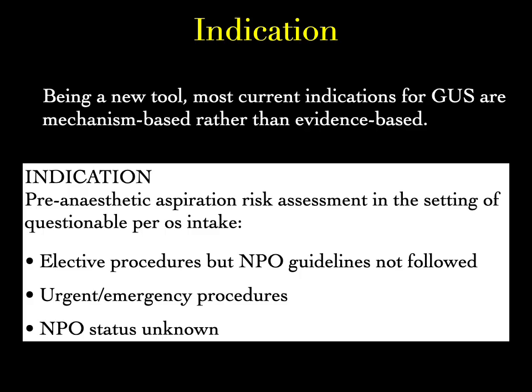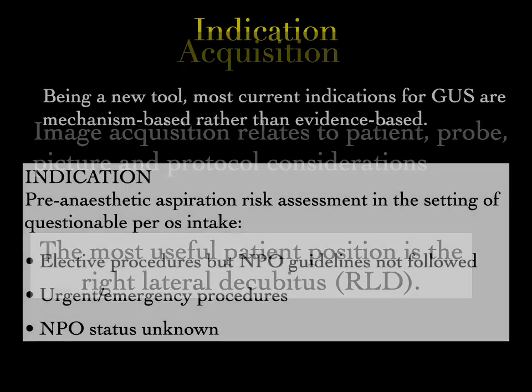It can also be done when somebody is unable to communicate, somebody with a trauma, or somebody unconscious. So in all these cases, you can check whether the stomach has contents or not. Then it helps you in the planning of the airway.